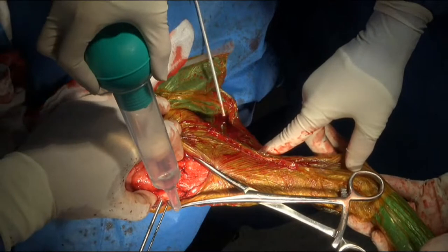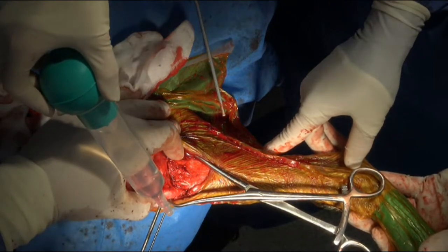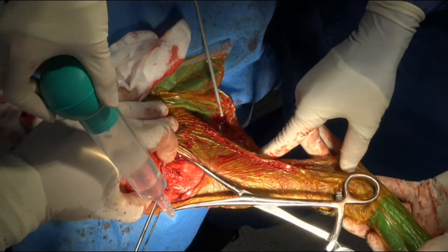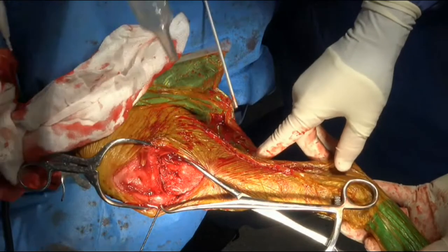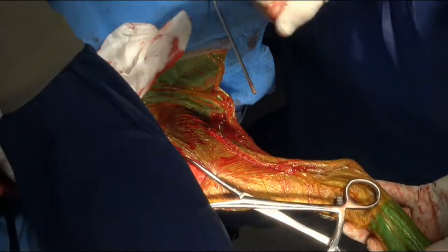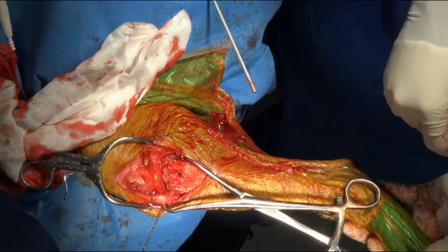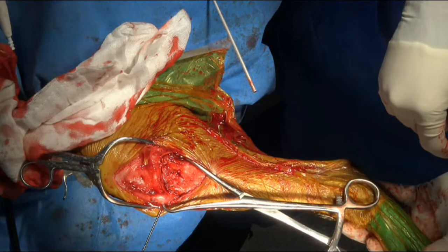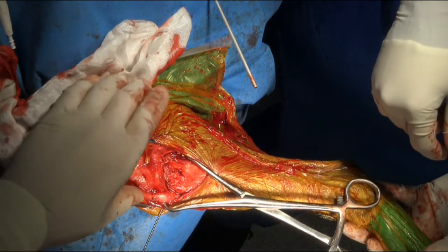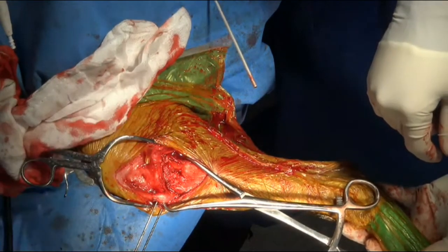It's cutting all pretty well. It's pretty soft bone. But if you're generating heat or if it wasn't cutting well, it's a good idea to basically take the drill out and clean it out, just to make sure the cutting flutes are free of bone and that it's going to actually cut effectively and efficiently. What I'm going to do here is just put this pin back in the hole. I'm going to leave that in there.